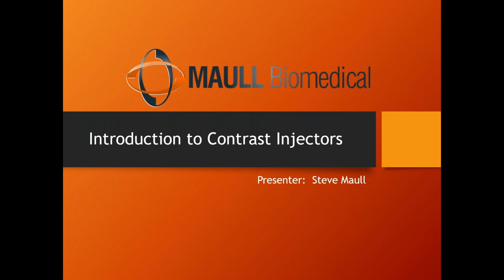Now, one thing about how an X-ray is produced: those X-rays that went into the patient are either going to penetrate the patient and hit the plate, or they're going to be absorbed by the patient and not get to the plate. So we have penetration and absorption. To get a good X-ray image, we need both things to happen. We need some of that radiation to get absorbed by the patient, and we need some of it to pass through the patient and strike the plate.